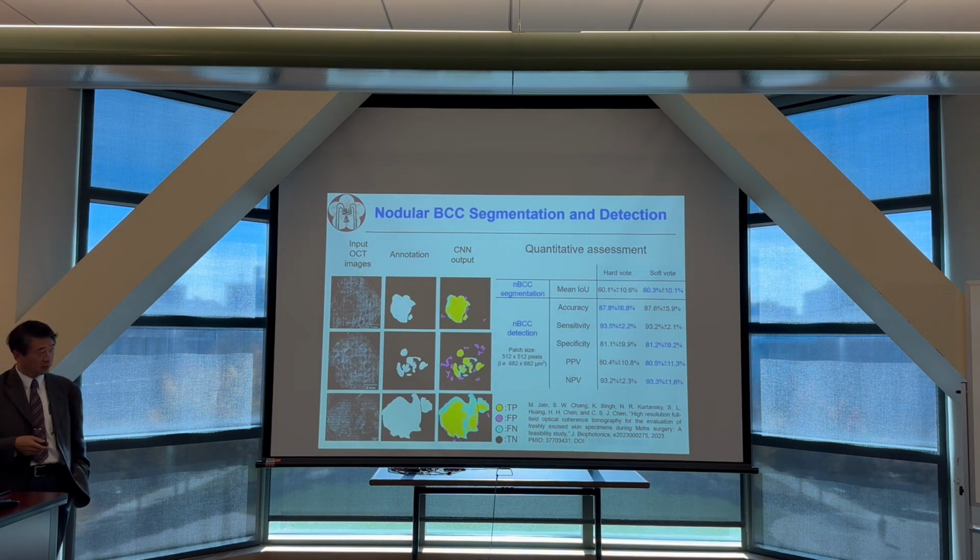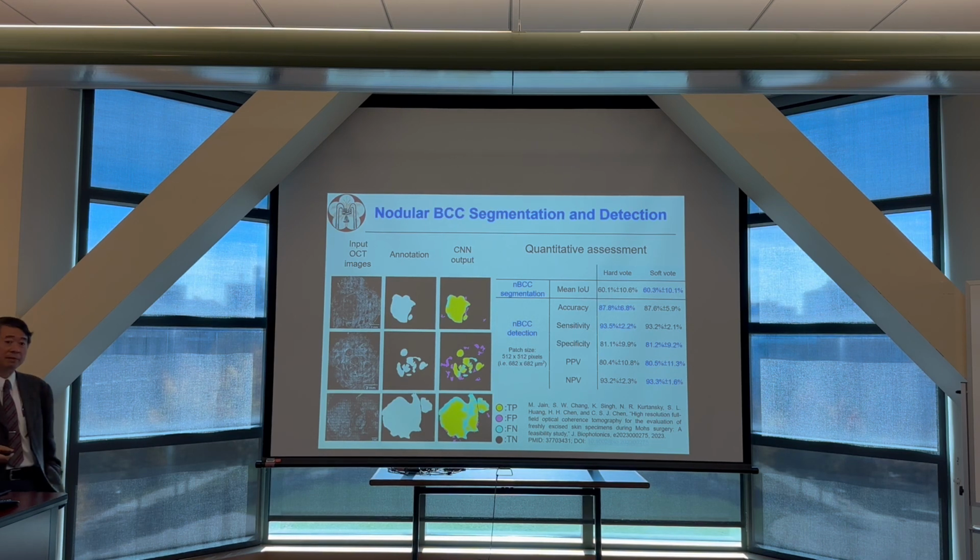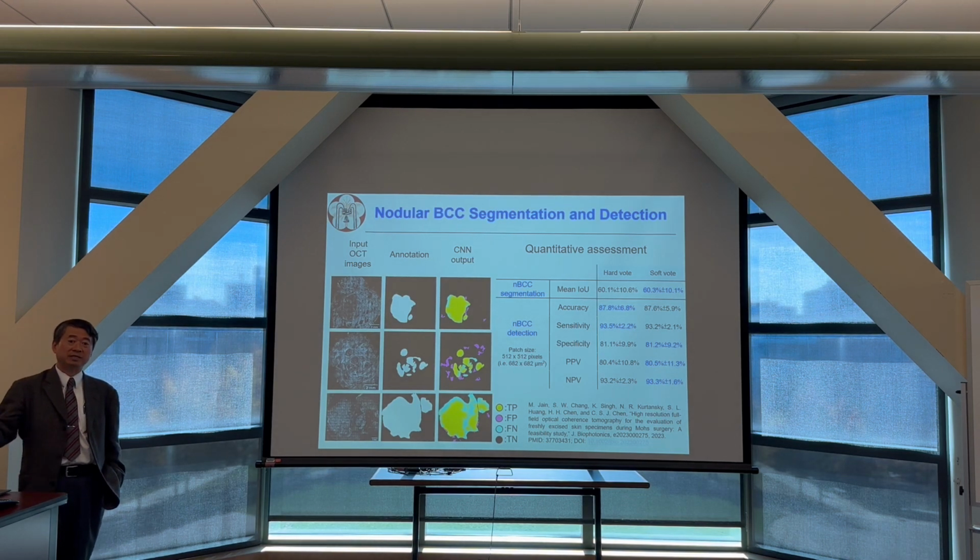If you want a quantitative assessment, for the basal cell carcinoma detection, the sensitivity is more than 90%. The specificity is a little bit lower, more than 80%. But remember I mentioned for deep learning, the larger the data set, the better the performance you can expect.